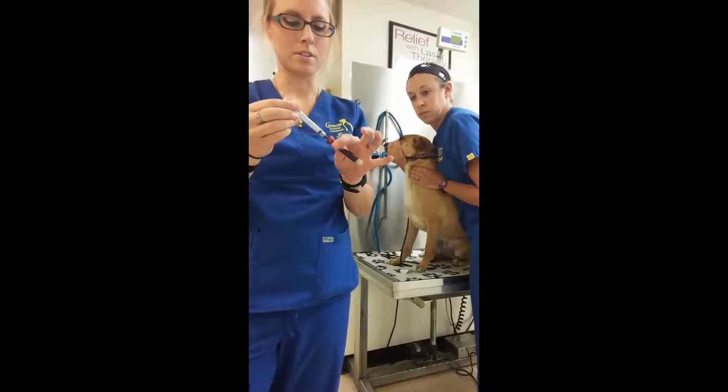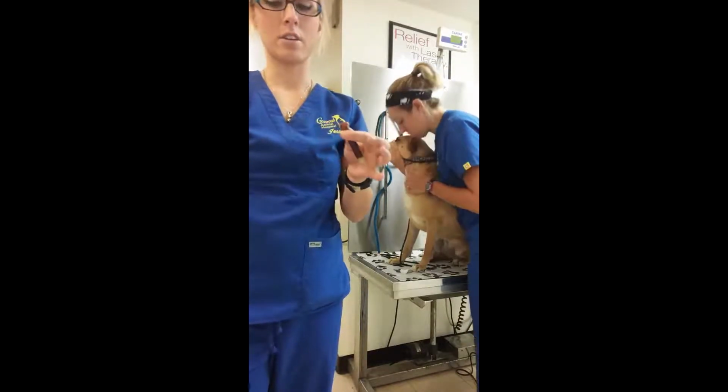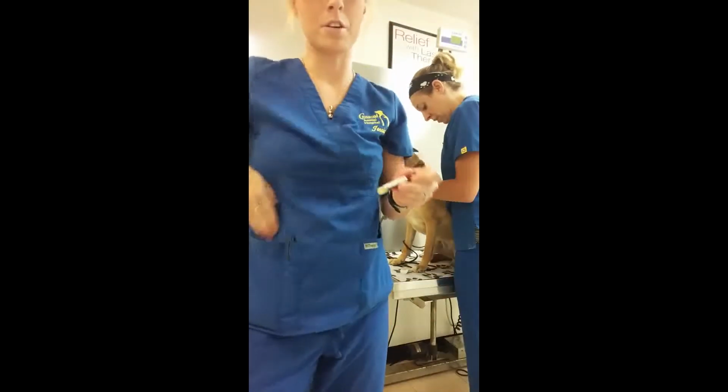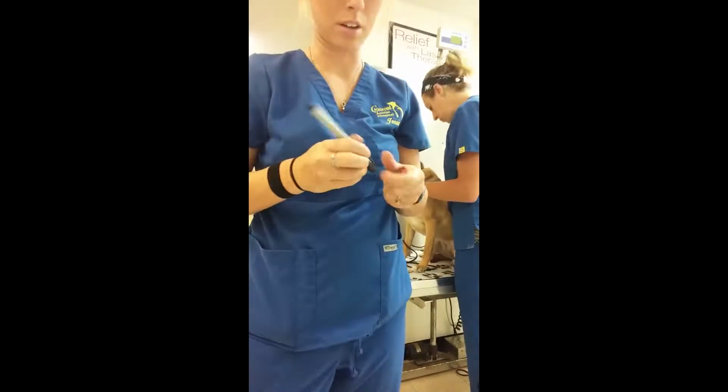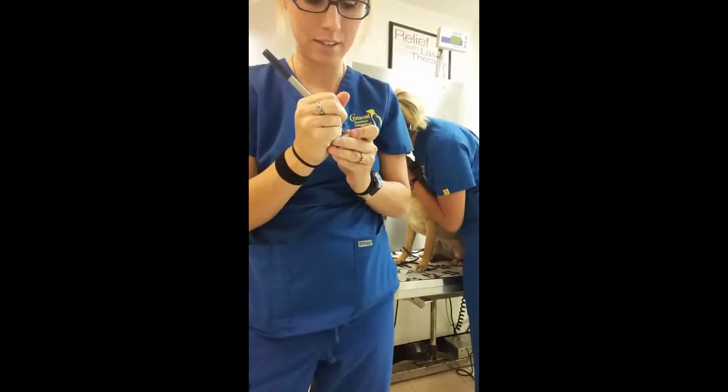And then we're going to let it sit for about 10 minutes to clot, and then we'll spin it. I'm also going to go ahead and label this with our name and our account number and the date.